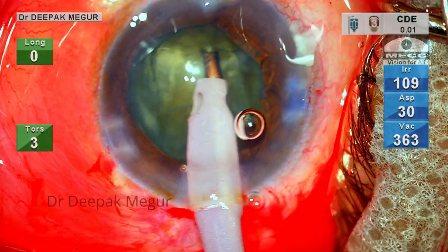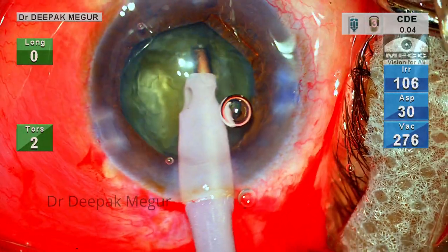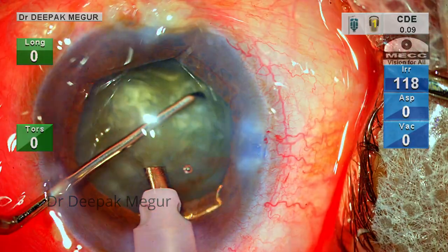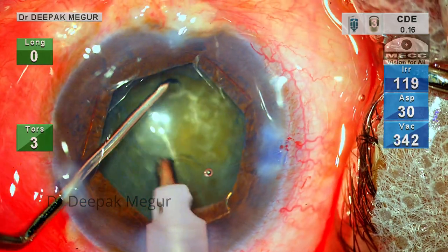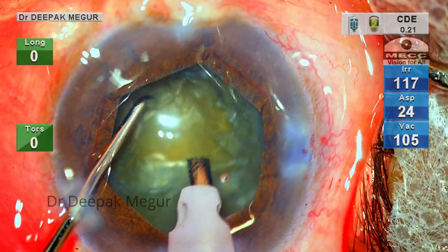Usually I would have inserted the CTR at this stage before proceeding with emulsification, but in this case I deferred the insertion of the CTR since the zonulopathy did not seem very bad at this point.